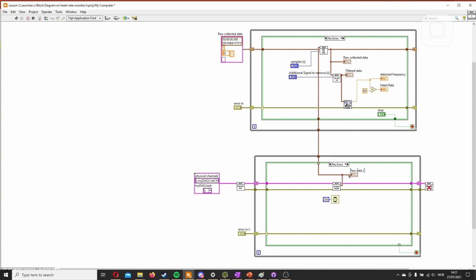They are wired together, this will send data up here, but what will actually happen now is that this loop will start, and this loop will wait until this one has stopped, and then the last data from this one will be sent up here. It will not work as intended. It will just first do acquisition for as long as you want, and then work with the same data set over and over again.